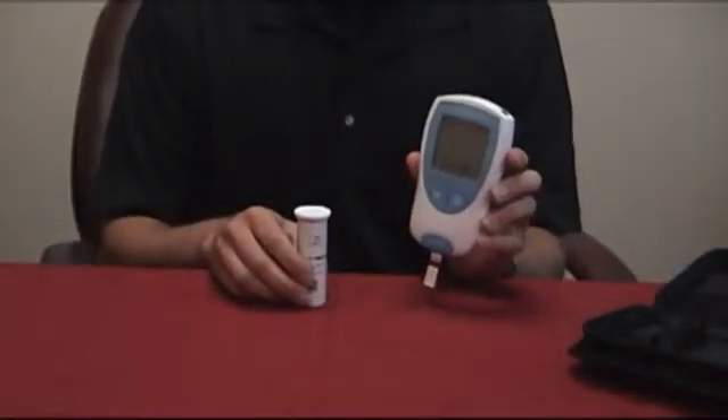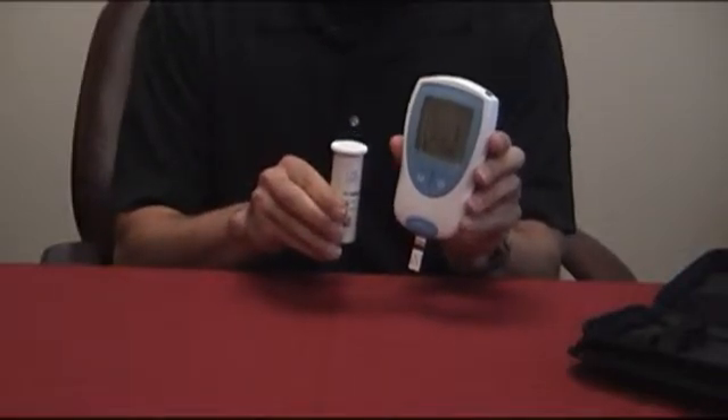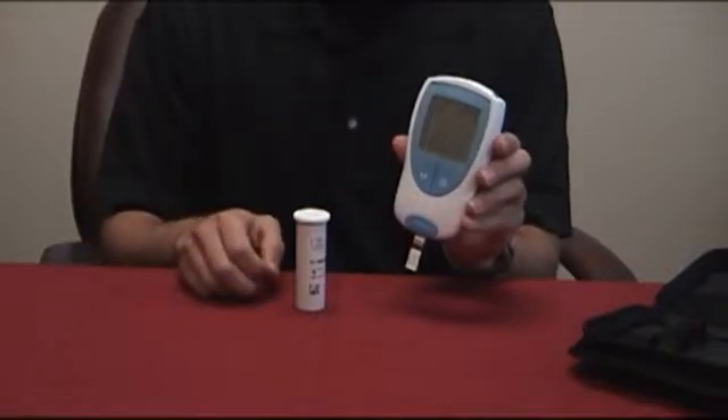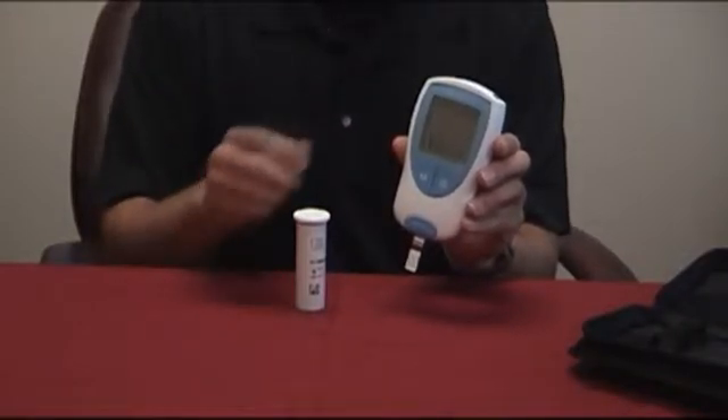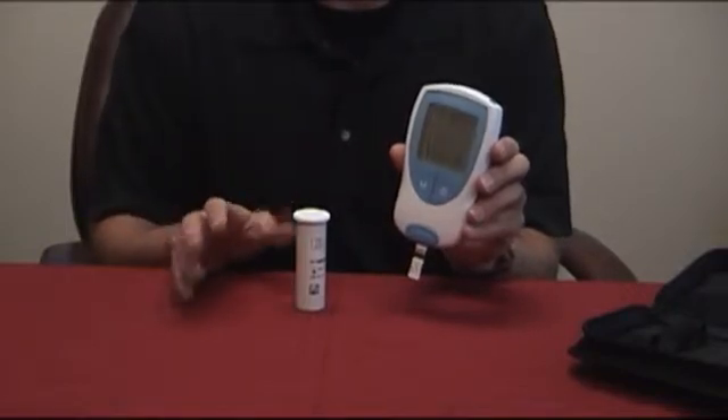When the three-digit numerical code appears on the screen, make sure that it matches the code on the vial of test strips. If it does, go ahead and press M for match to start the 30-second warm-up period. An hourglass will then appear on the screen. Do not apply blood during this time or prick your finger.